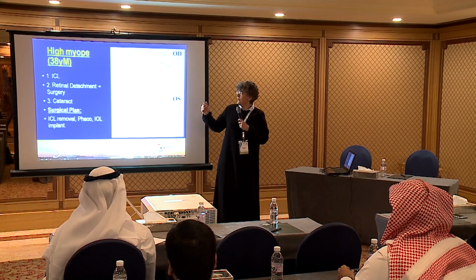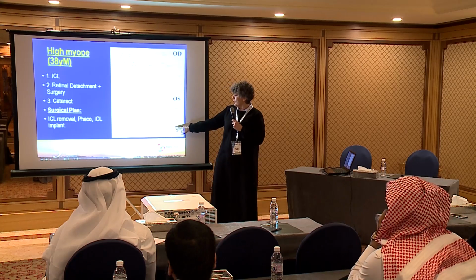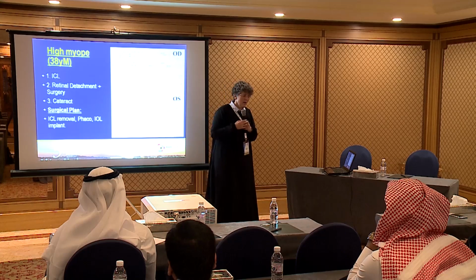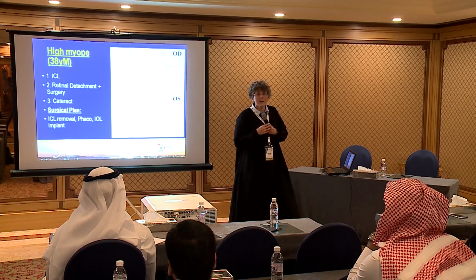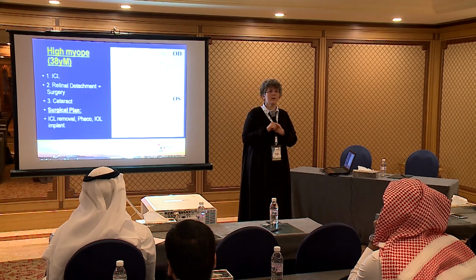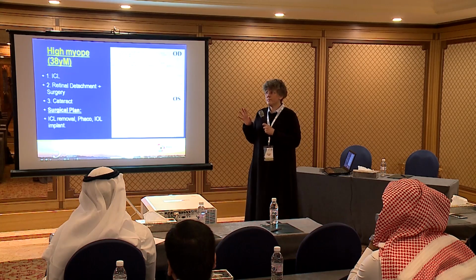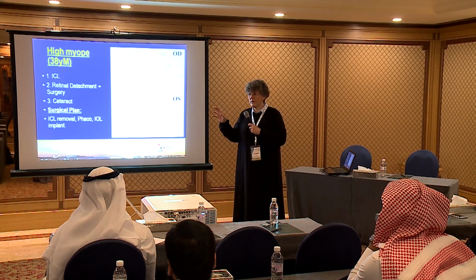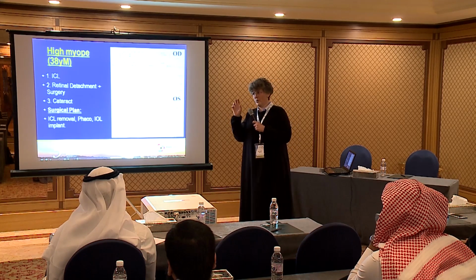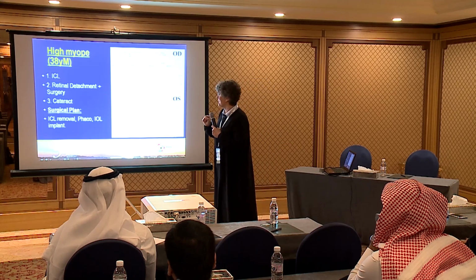I took out the lens, and I also told him, listen, you know, I will be needing such a lens for you, a 3 diopter lens or 3.5 diopter, 4.5 diopter lens. They don't really exist in multifocal IOLs. It's not completely true what I'm saying. Zeiss goes in multifocal down to 3 diopters. Alcon starts at 6. I think the difference means a question of liability. If you start at 6, you're being smarter because your results are better.